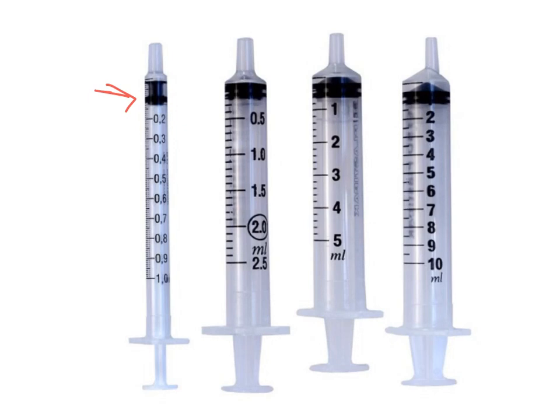Obviously, there's no needles on this example picture, but you take it and you put it into a vial, and then you can draw the medication into the syringe to the certain point, depending on how much medication is needed. So most of the time syringes are labeled in either milliliters, or sometimes you might see cc's, and cc's is the same thing as milliliters. It's just a different way to list that. But you can see there's lots of different size syringes based on what is needed.